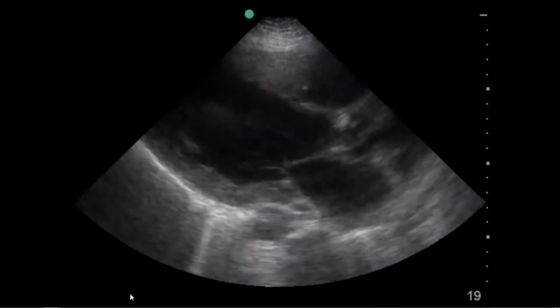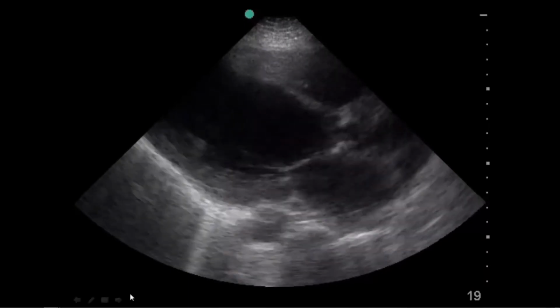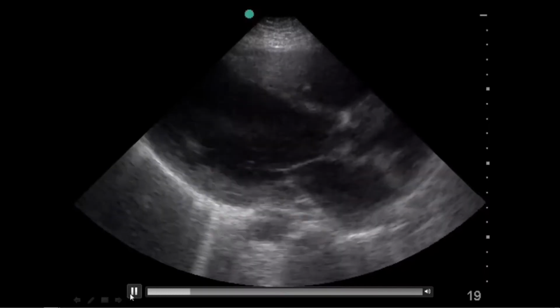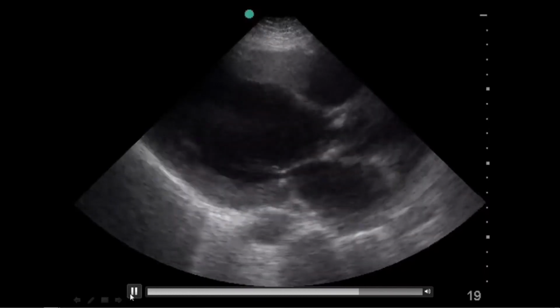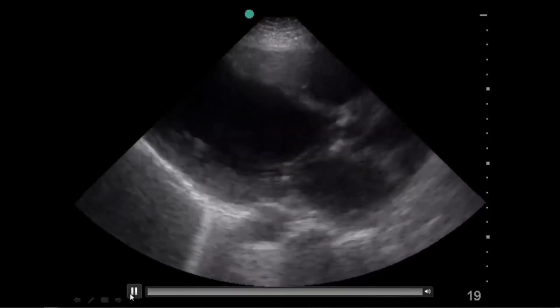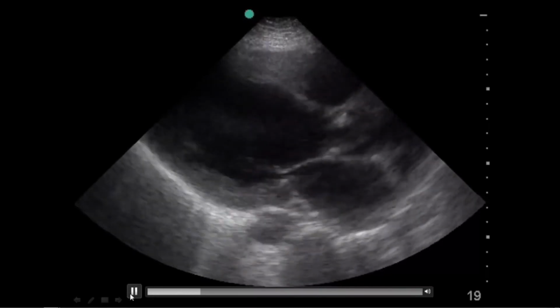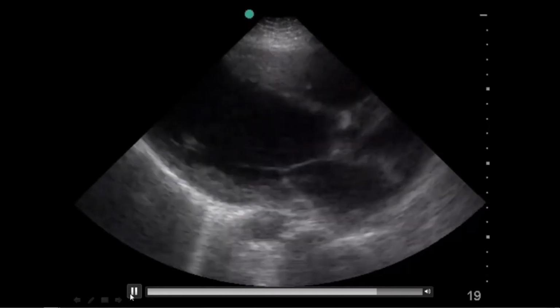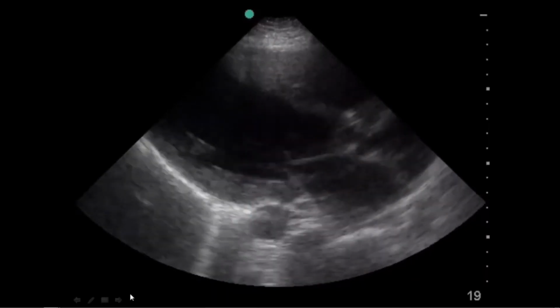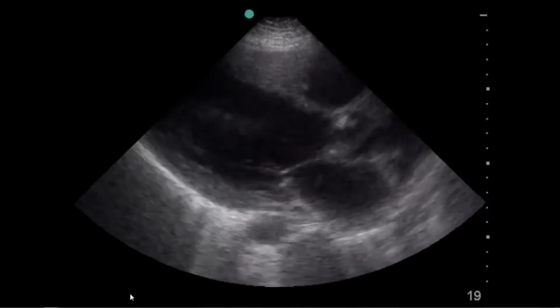And here again we see another heart that looks like it's working pretty hard to beat, and when you look at it at first it seems like it's doing pretty well, but then you see that the septum here is only sort of moving back and forth. It's not really thickening as it contracts. There's not a lot of organized motion towards the center of the ventricle, and the mitral valve again is only getting about halfway in between the posterior wall of the ventricle and the septum. So there's poor E-point septal separation, there's poor concentric contractility, and there's very poor thickening with contraction. So again, another example that might fool the eye at first, showing you poor contractility.